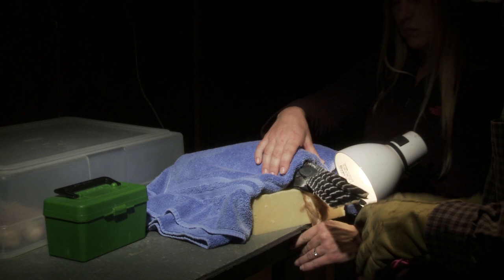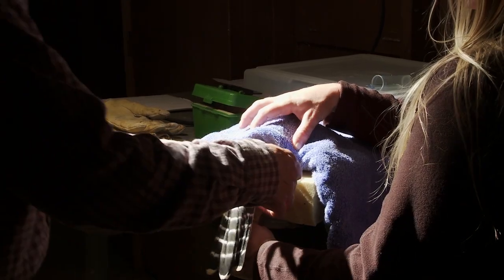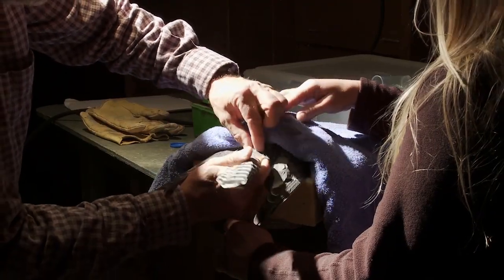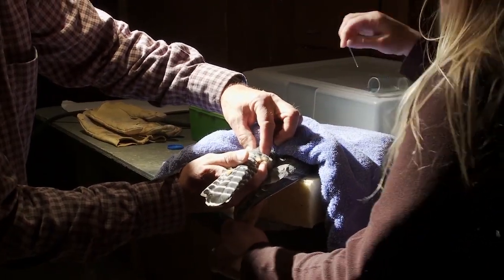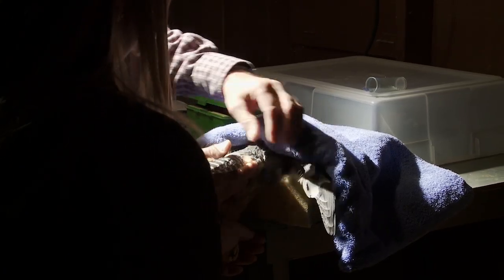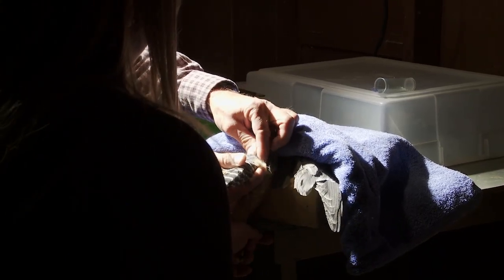An important step is to hold the falcon's legs at the feet and lock your fingers under the edge of the table while gently holding the falcon under the towel with your other hand. This holds the falcon in the correct position. Cal spreads the wings out of the way while Heather grabs a capillary tube. Cal firmly but gently massages the falcon from the back of the ribs to the pelvic girdle several times.